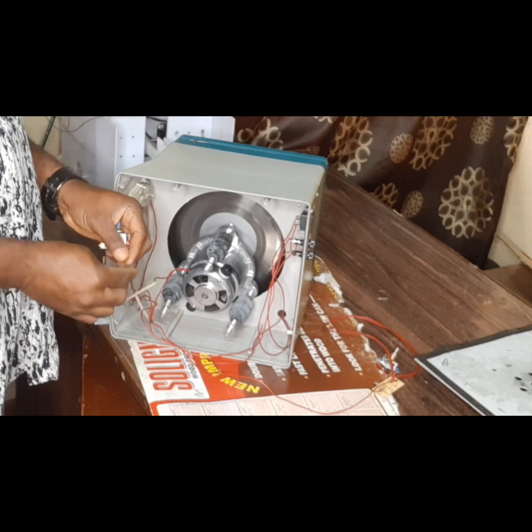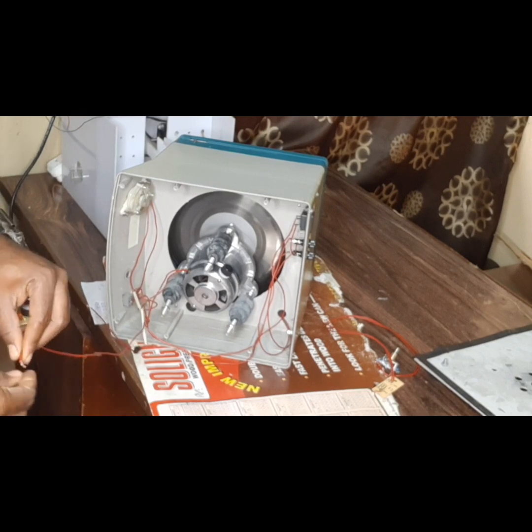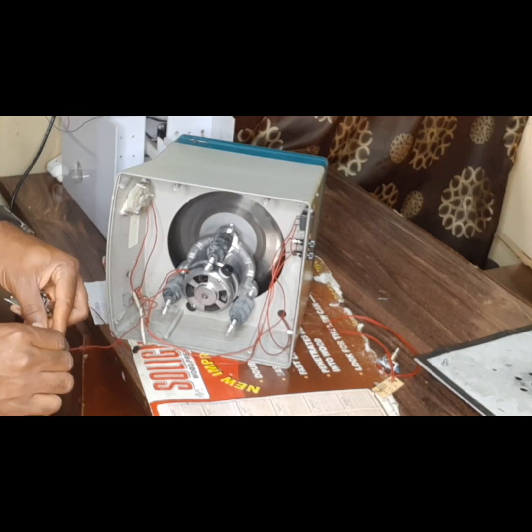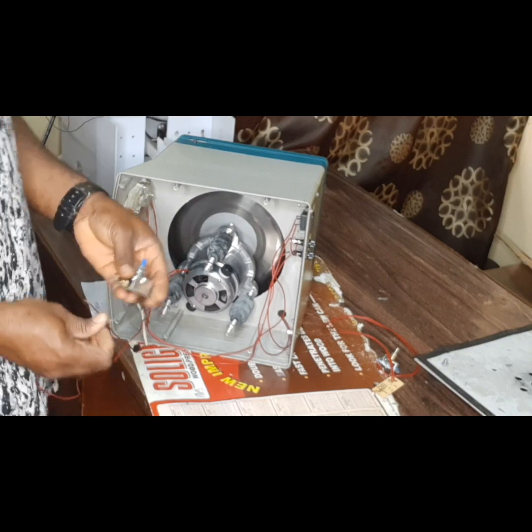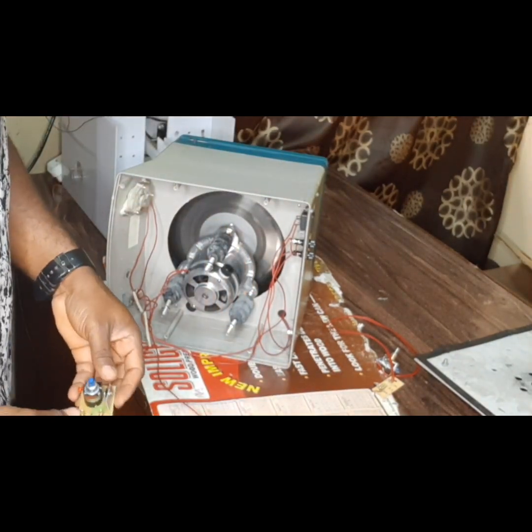So one terminal of the motor is going to go in here. Remember, in using this, there is input and output as well. So this is the supply to this. So I will have to identify which one is input and output.